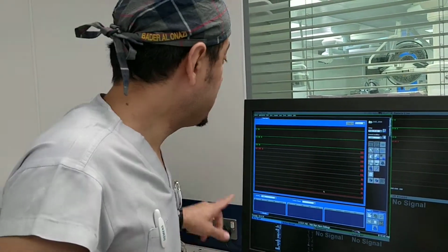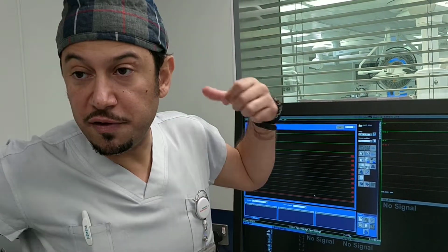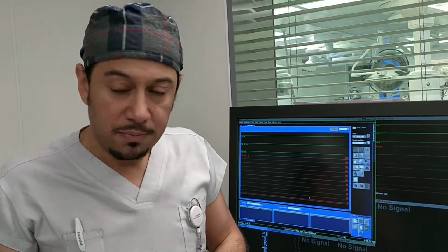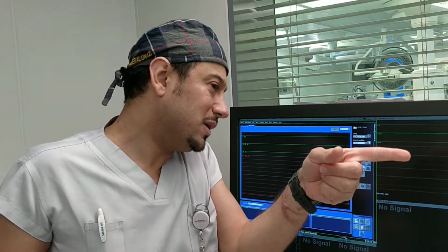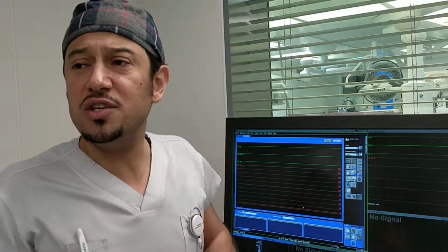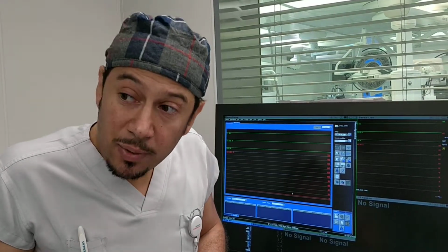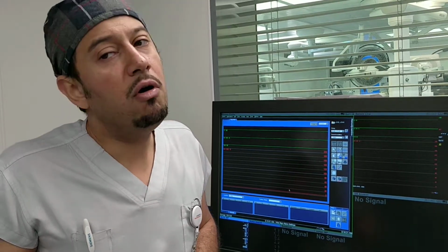Now, remember, these are ECG leads. You connect, remember I told you to connect 5, right? It's going to give you 3 readings, right? Now, the doctor comes and he sees some ECG changes. Prabhu comes and he says, Doctor, we got changes in lead 2, for example, okay? And the doctor says, we have inferior changes. Something happening where? In the RCA, right? Inferior. All that can be wrong.